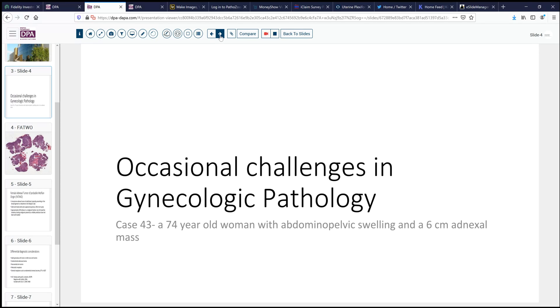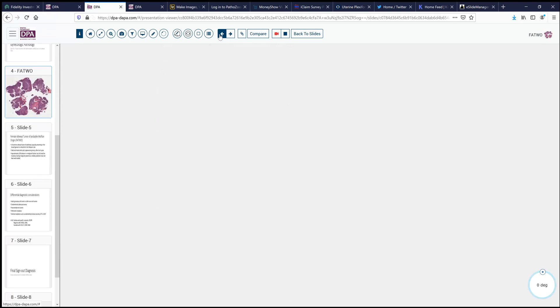At operation, the surgeon found the lesion to be primarily in the broad ligament, without an obvious attachment to the ovary or specifically arising from the fallopian tube. So that presents a rather limited differential of lesions, amongst which are the findings in the current case.